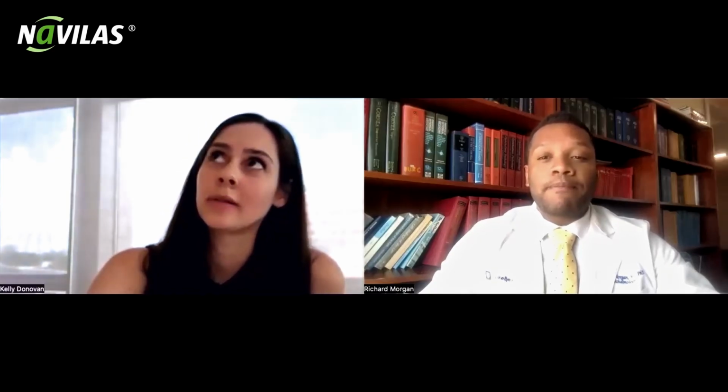Yeah, I agree with that. If a patient had a really small hole or even a tear that was not super peripheral and wasn't difficult to see, I think probably it'd be easier to just kind of whip out your slit lamp or your indirect. But for patients who need more laser than that, even though there's a little bit of that extra setup time with the Navilas, in those cases, it's definitely worth it because you gain so much extra time during the treatment phase. Yeah, absolutely. So what do you think about the Navilas as an education tool?